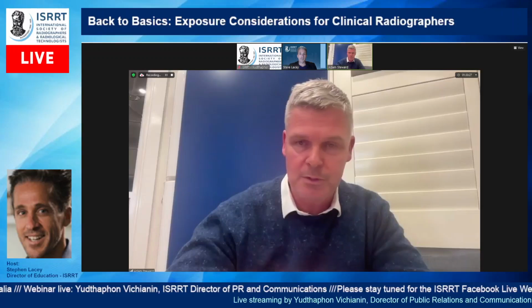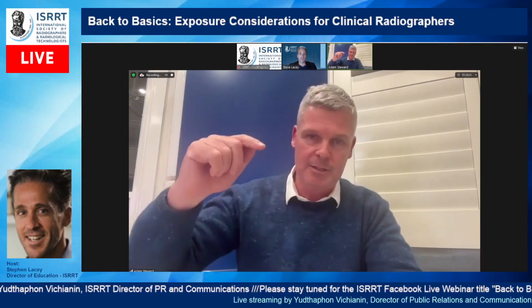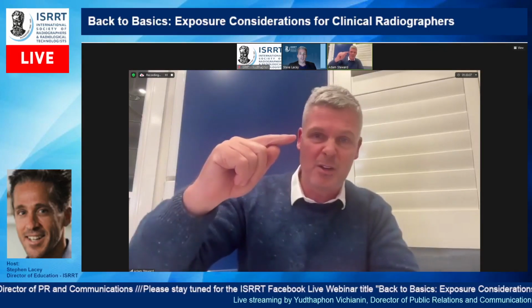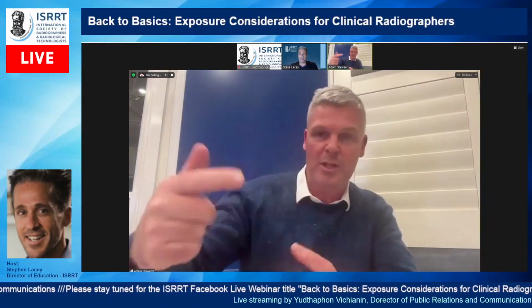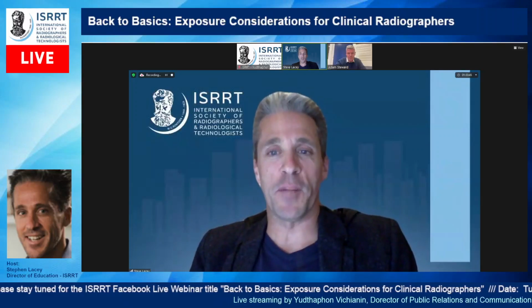Now, sometimes the thickness might be a bit different. Actually, I think it's a bit higher, so I'm going to change that. But the simple rule for using filters, a really simple way: put the filter to cover the area you want, and set your exposure to get through the thickness where there's no filter. So again, use your half value layer. Okay, it's actually 5 centimetres thicker than I normally would, so I want to give double this, and away you go. But don't set your exposure factor until after you've collimated.